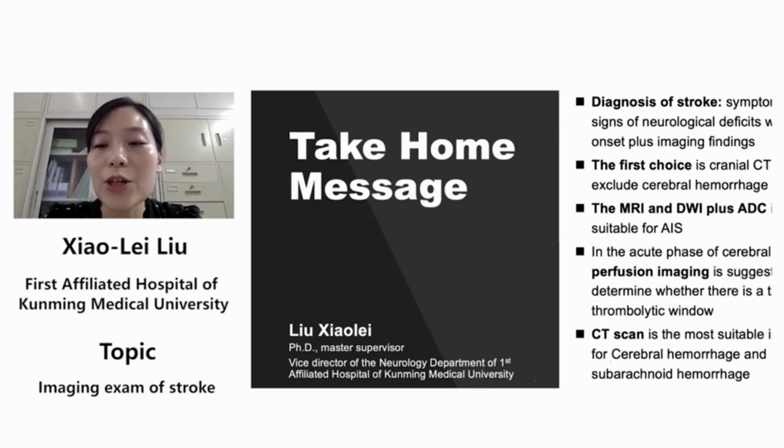In the acute phase of cerebral infarction, perfusion imaging is suggested to determine whether there is a tissue thrombolytic window. CT scan is the most suitable imaging for cerebral hemorrhage and subarachnoid hemorrhage.